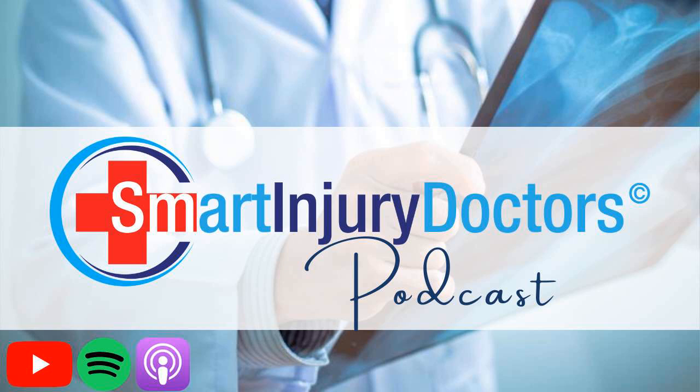But what I want to end with is you can't see translation findings. You cannot eyeball this stuff. So if you're out there saying, and if you talk to somebody like me and you say, hey, look, we eyeball our x-rays and then we send out, I don't know what to say to you. That's because it's very difficult to communicate with you because what you're saying is not true. So my only way to communicate with you is to invalidate you or to show you that what you're saying is not true. And it's a tricky communication.